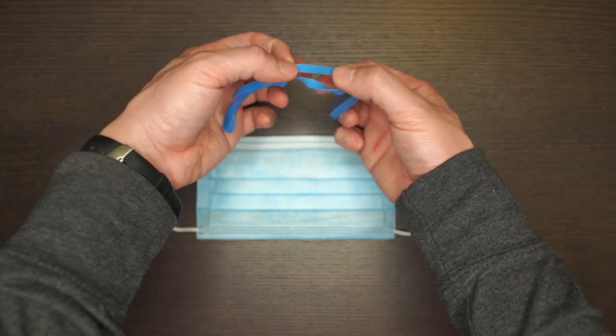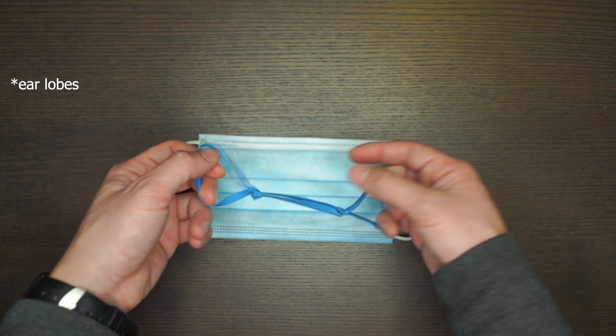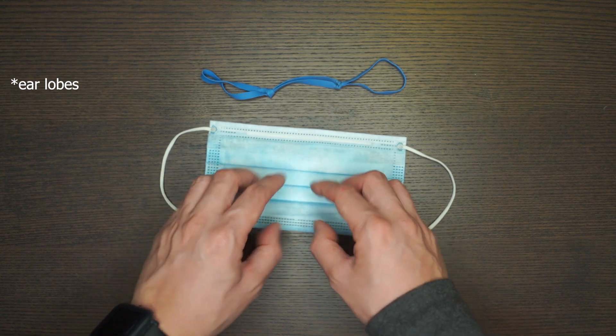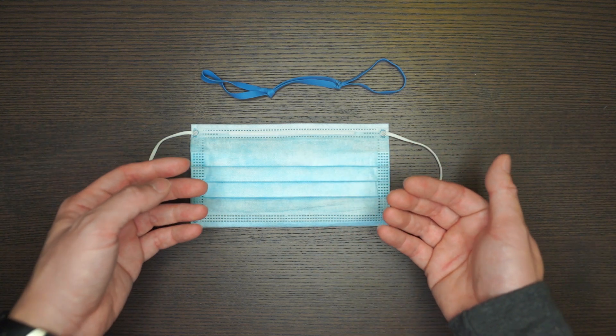What this does is create three holes. The hole in the middle covers around your nose and your mouth, while these are your ear loops. What it does is make a tighter wrapping around your mouth so that airborne particles are not able to go in through the sides and underneath your mask.